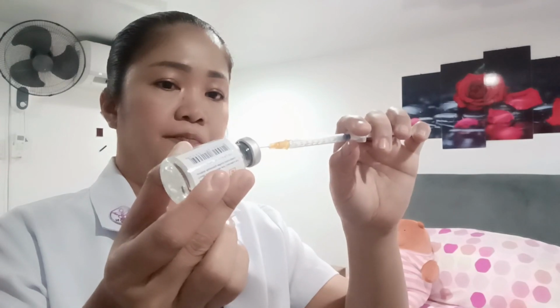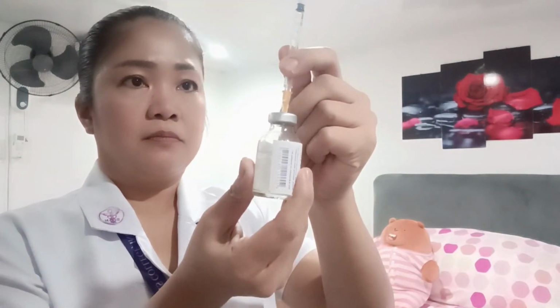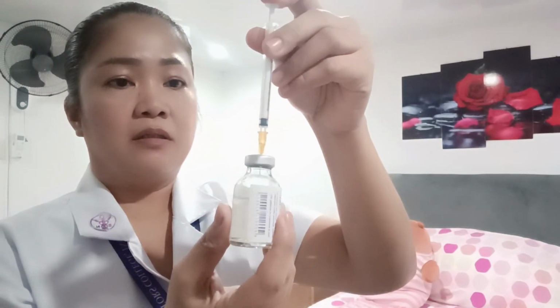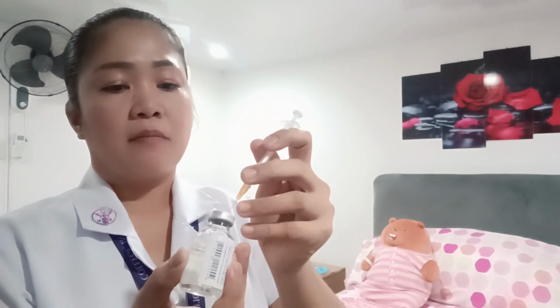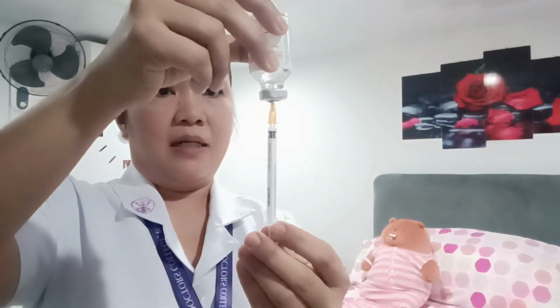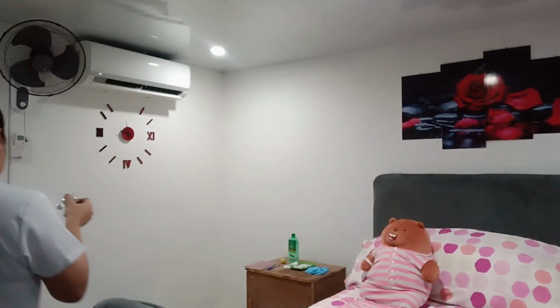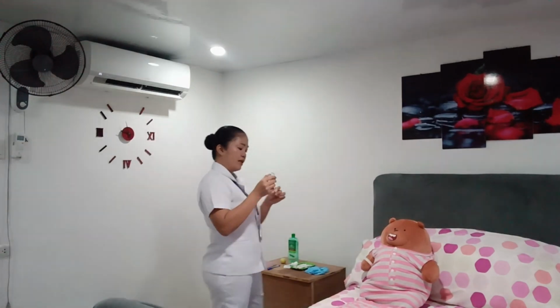So what I should do is insert this into my vial, release the air, and then take it out, and then you put it back, and then you could take out the 1 cc of medication.